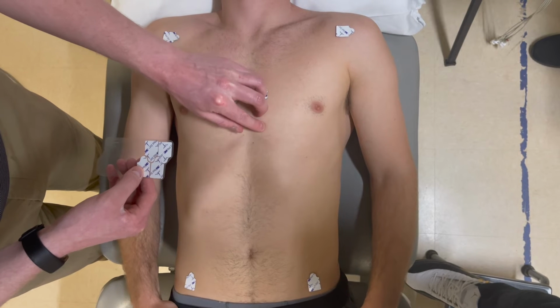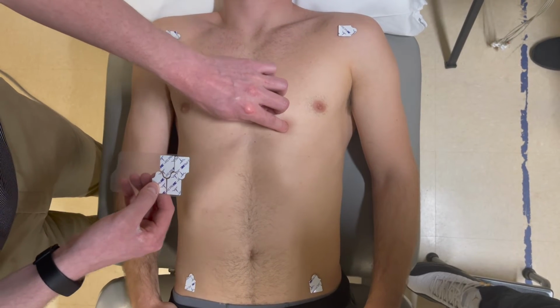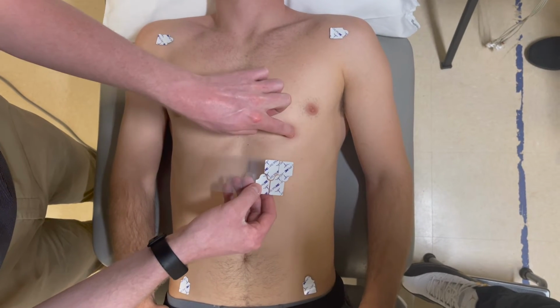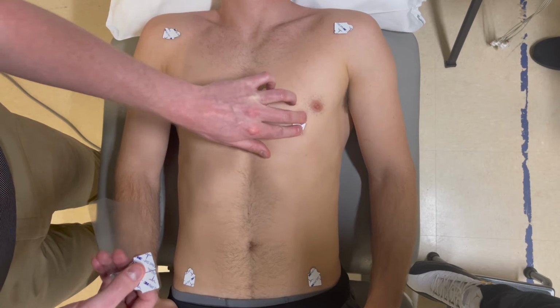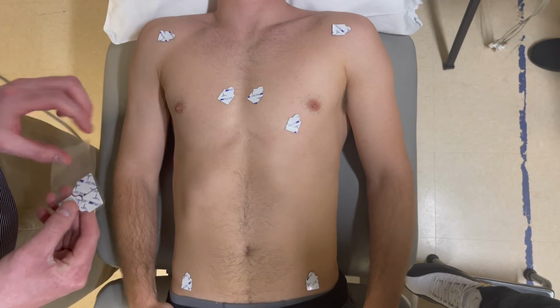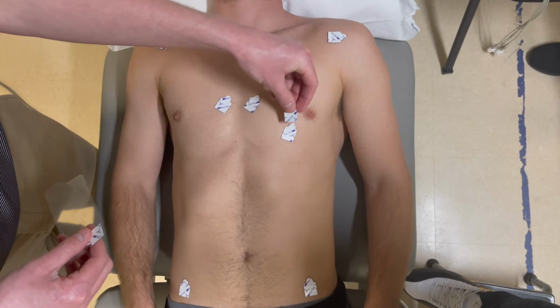Next, we will skip V3 and place V4 in the 5th intercostal space at the mid-clavicular line. Then we will place V3 between V4 and V2.